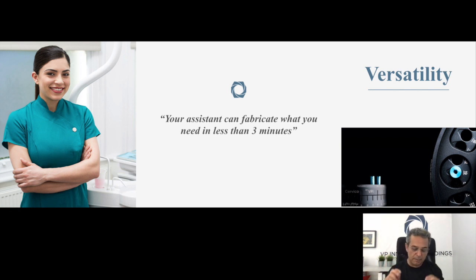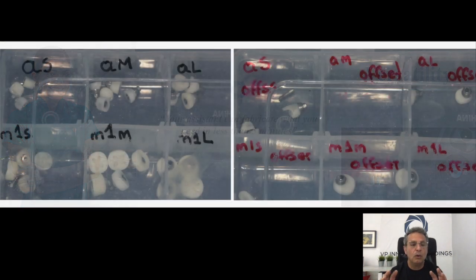But at this moment, I'd like to make it a little bit more clear that it's better to plan ahead. This is what we do. We have cassette boxes with all these parts because, again, Ioannis works as a referral dentist. He's working with many different brands. So we have all these cassette boxes already organized with the implant brands inside and the custom healing abutments that need to be created and impression posts. So the girls have planned the program for the day or the week and they know what they need to have. So these are already pre-made.